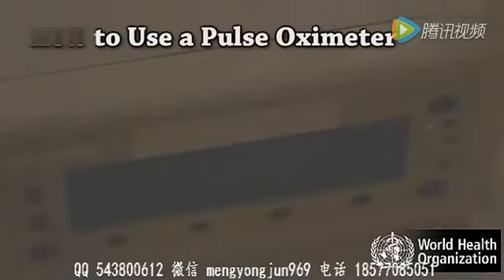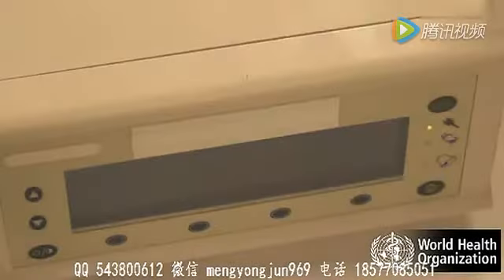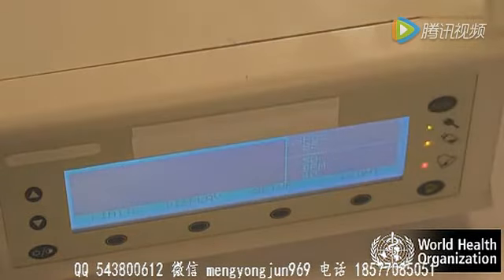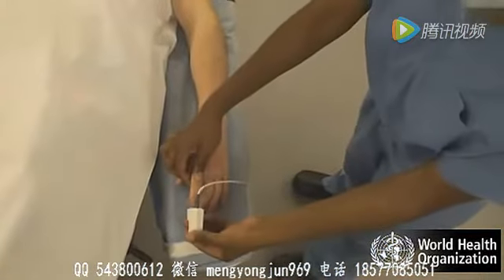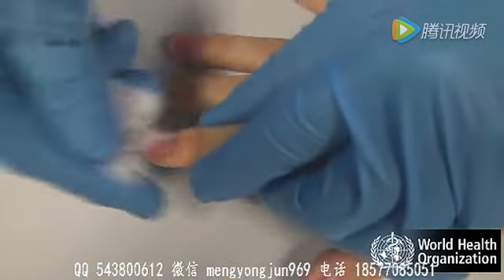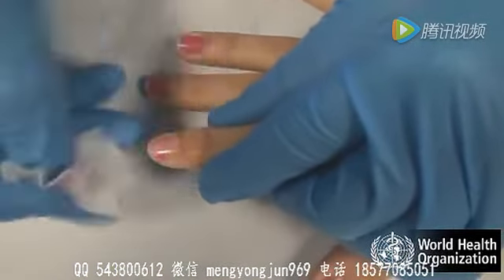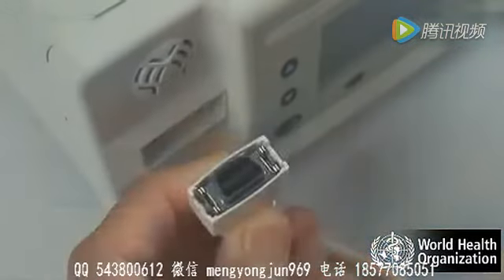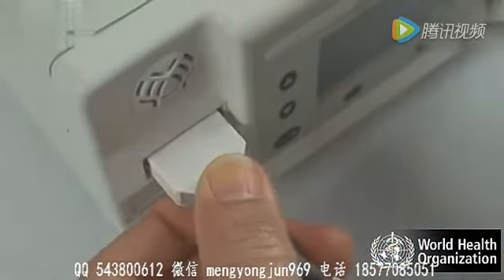How to use the pulse oximeter. Turn the pulse oximeter on. It will go through internal calibration and checks. Select the appropriate probe with particular attention to correct sizing. Make sure the intended placement site is clean and remove nail polish if necessary. Connect the probe to the pulse oximeter.